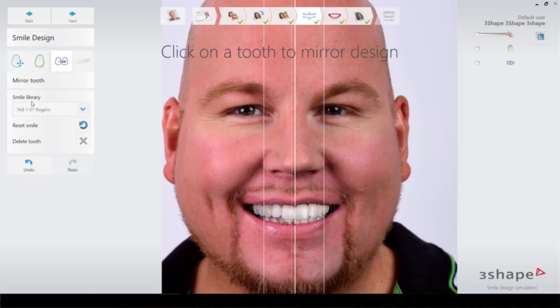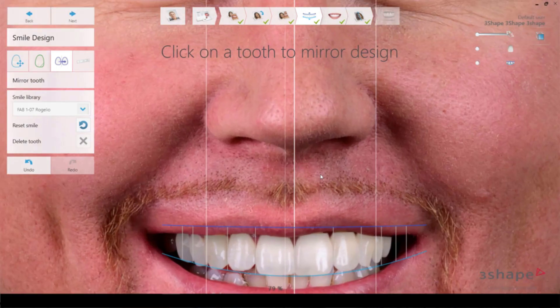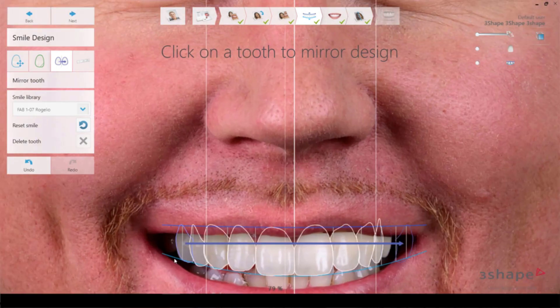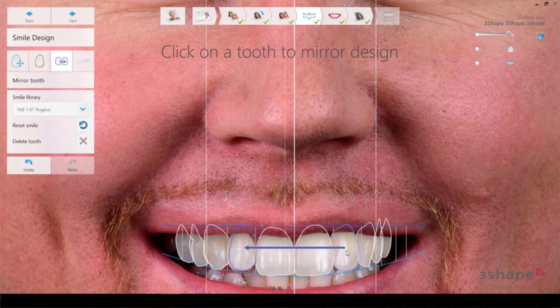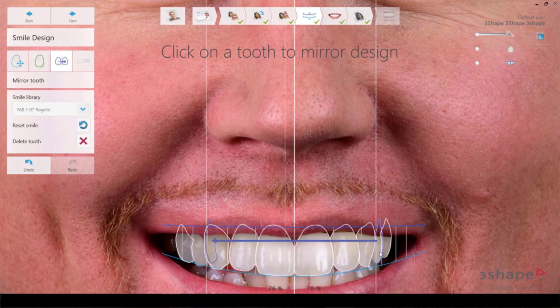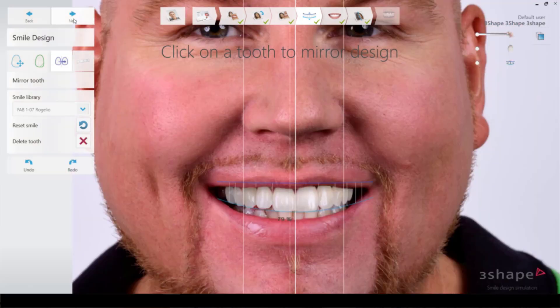You can also mirror a tooth — so if you really want symmetry and you prefer one side over the other, you can choose to mirror teeth like that.